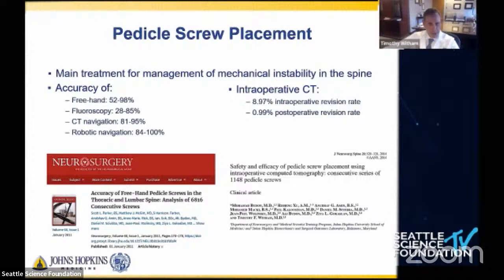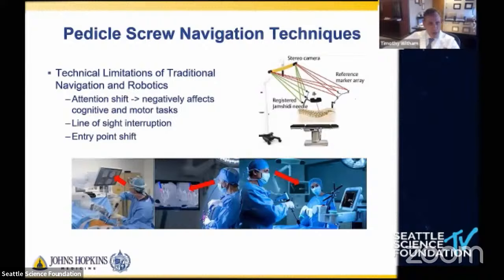Now, standard navigation systems and robotics have certain limitations, including line of sight interruption from a remote camera, entry point shift, but one of the big ones is this concept of attention shift. And that is this concept whereby you have to look away from the patient at a remote computer screen while you're operating on the patient in front of you. And most surgeons that utilize this technique are extremely good at adapting to that, but it can negatively impact cognitive and motor tasks.